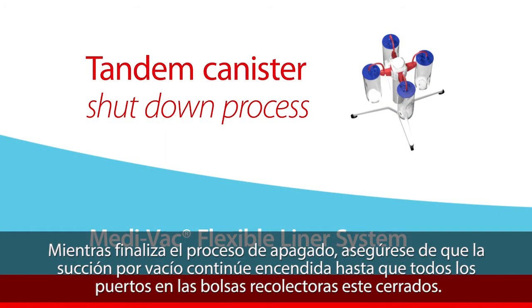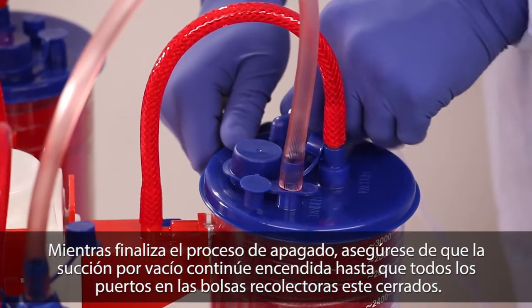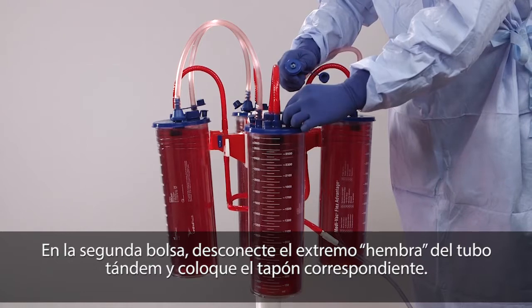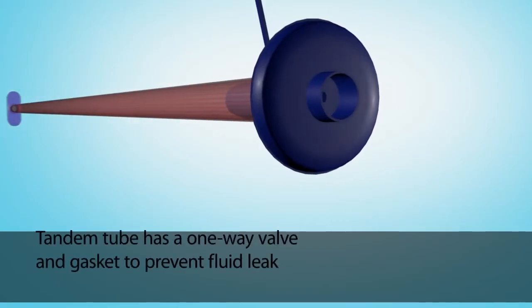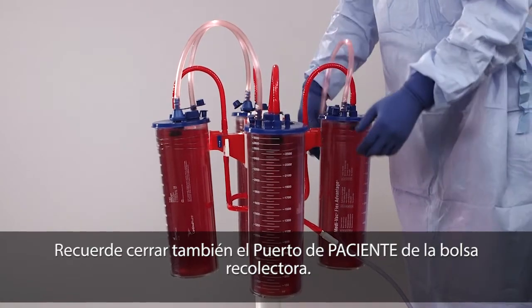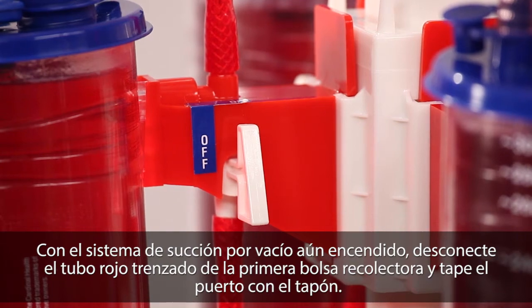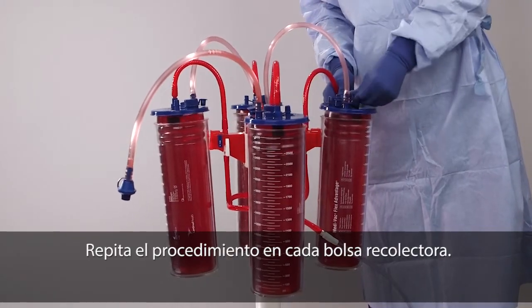While completing the tandem canister shutdown process, ensure the vacuum suction remains on for all flexible liners until all ports are capped. On the first liner, disconnect patient tubing and firmly cap the patient port. On the second liner, disconnect the female end of the tandem tube and, using the attached cap, ensure a secure seal. Remember to also close the patient port on the flexible liner lid. Repeat these steps for all remaining liners. With vacuum suction still on, disconnect the red braided tube from the first liner and securely cap the port. Repeat this process with each liner.